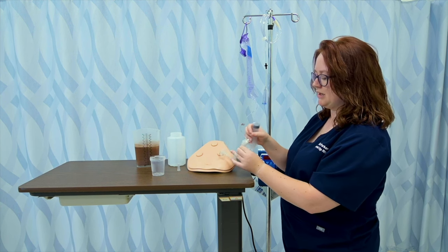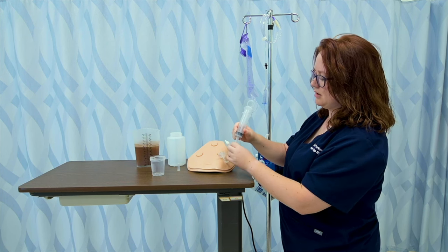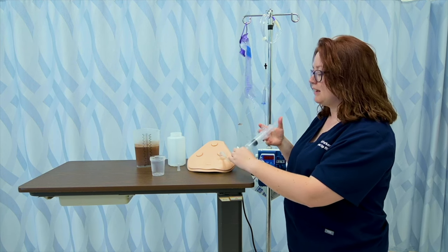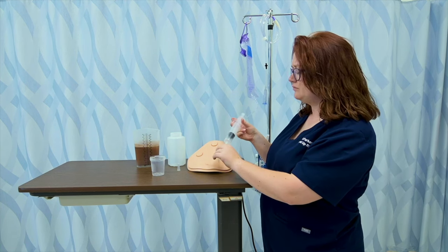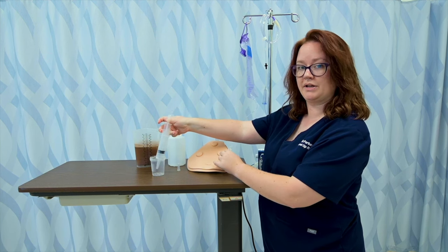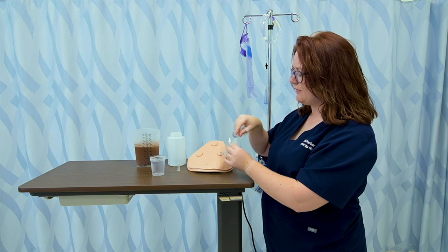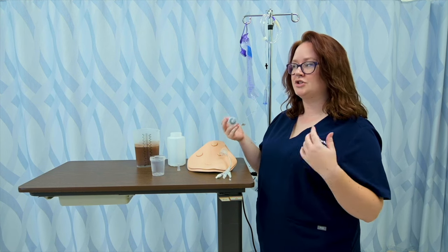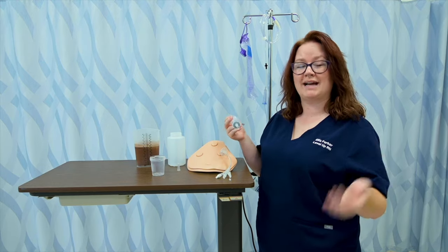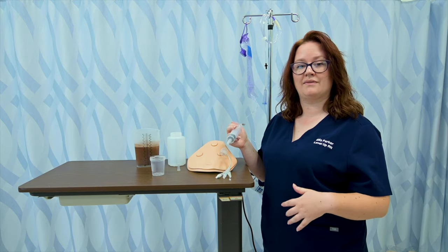I'm going to simply pinch the tube while I unplug it so it doesn't shoot out. I'll insert my piston syringe and withdraw on the plunger until nothing happens. My patient today has no GRV, so I would move forward. Otherwise, you need to follow your facility's policy — some facilities have you remove it, put it in a cup, and waste it; others have you reinsert it into the patient's stomach. A general guideline is that if it's over 500 milliliters, we need to reconsider continuing the feed, and our practitioner probably needs to be involved.